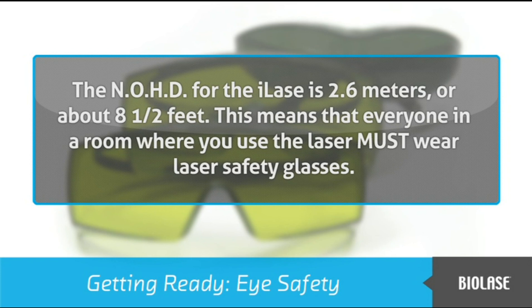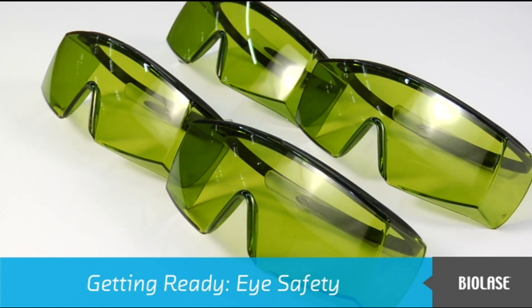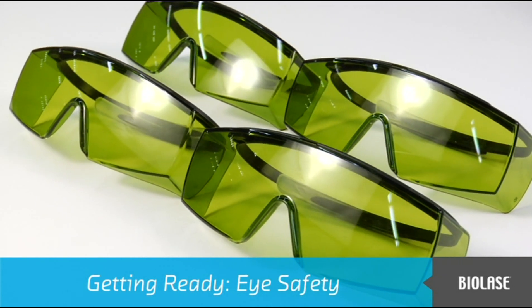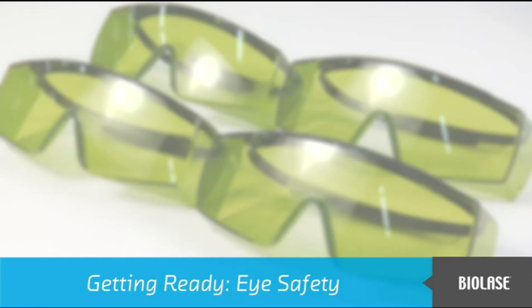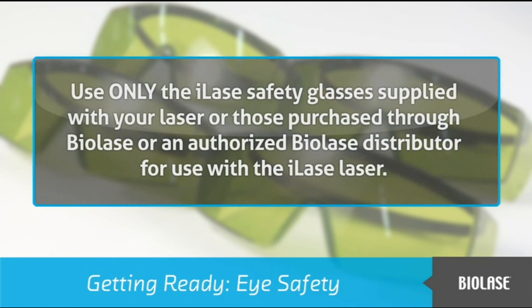This means that everyone in a room where you use the laser must wear laser safety glasses. The iLaze system comes with laser safety glasses especially designed to protect eyes from the particular wavelength of the iLaze laser. Using other laser safety glasses, even ones designed to block a similar wavelength, may provide no protection at all. Use only the iLaze safety glasses supplied with your laser or those purchased through BioLaze or an authorized BioLaze distributor.